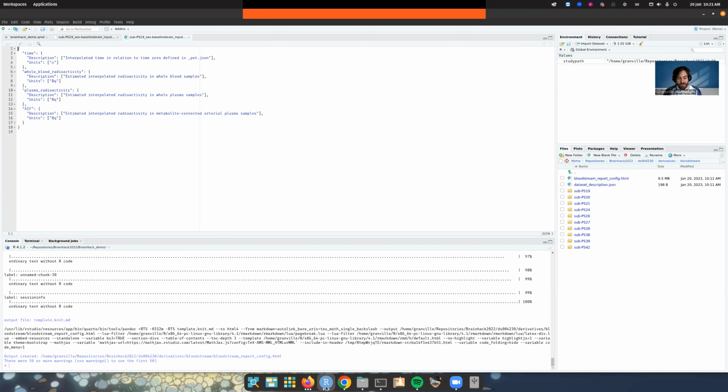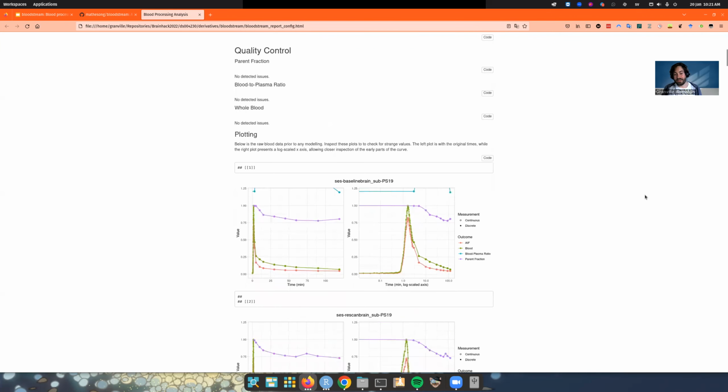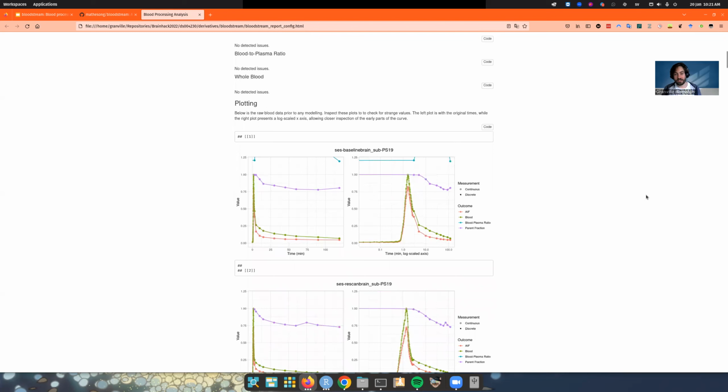It does mean, however, that it's used linear interpolation, which you can think of as not a modeling decision. I think it's better to actually think of it as a modeling decision. That is your decision. You've interpolated everything, and you could have fit a model, but you did not.